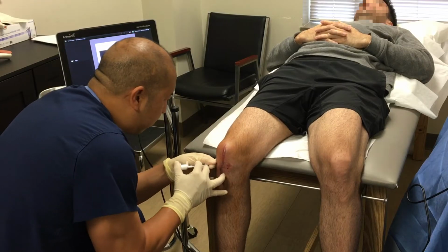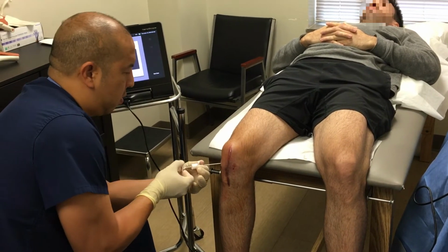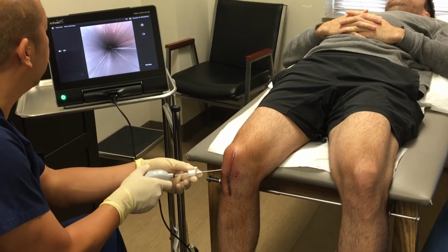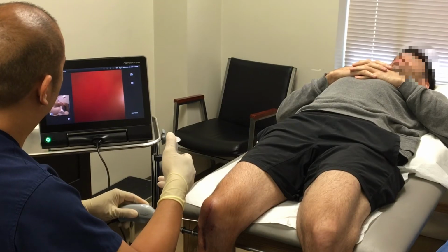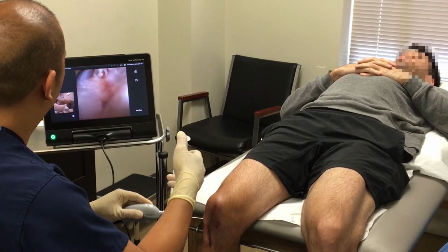I've anesthetized locally the arthroscopic portals. I've put in the sharp trocar into the notch and knee, followed by the NanoScope. In the office with the console, I can see inside the knee. I then have a syringe attached to the NanoScope and am insufflating the knee with saline.